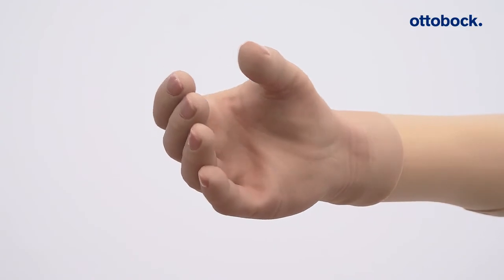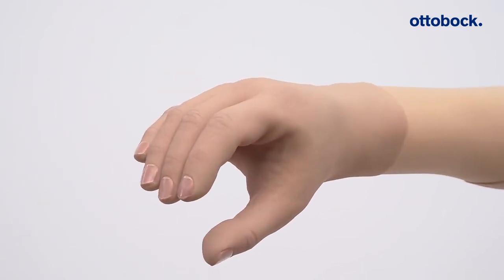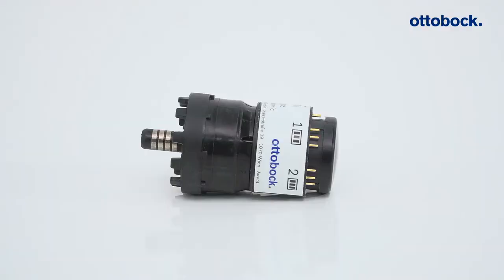For all Myo Bock hands, the active pronation and supination can be controlled by the MyoRotronic electronic in combination with the electric wrist rotator.